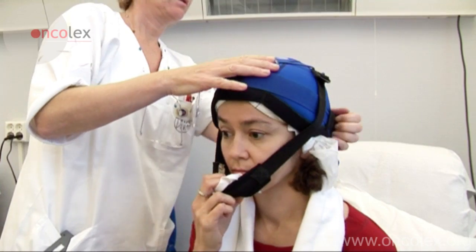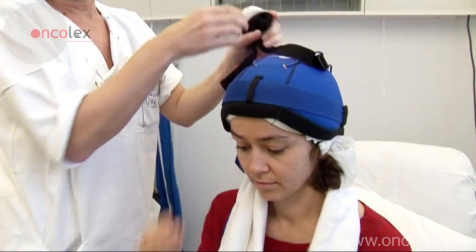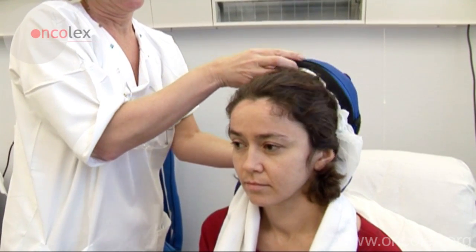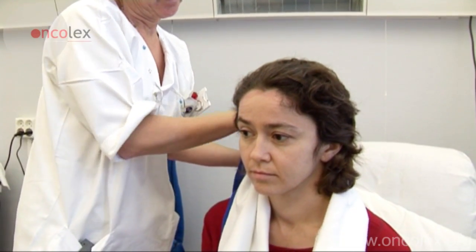After the treatment is finished, the cap is removed, along with the paper cap and sponges. The cooling cap is washed in lukewarm water to remove any frozen condensation and to clean it for the next patient.